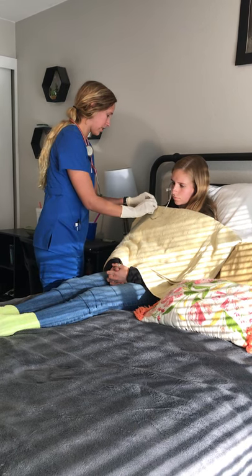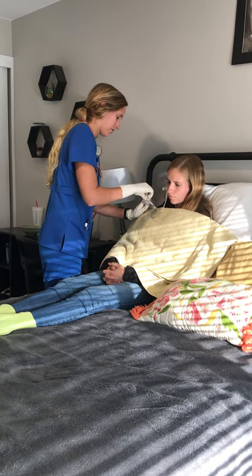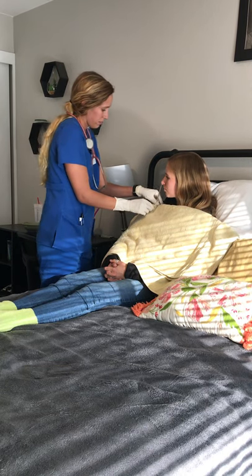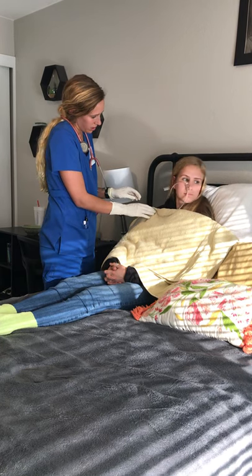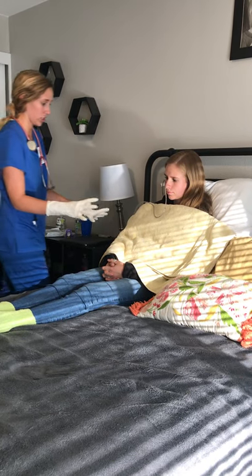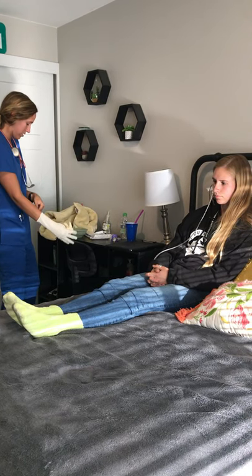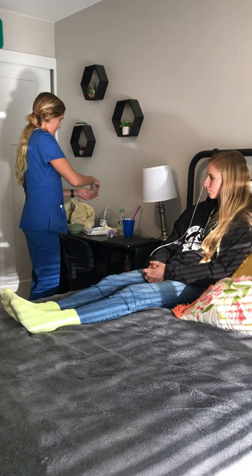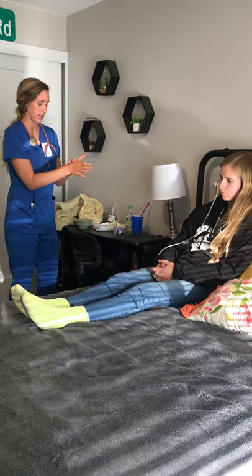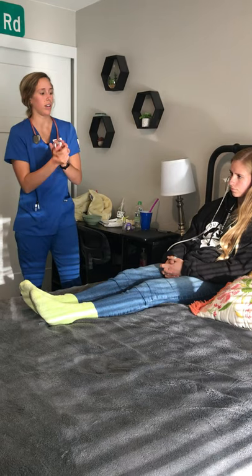Next, I'm going to secure it to her gown. Normally I'd use a rubber band and a safety pin, but I'm going to tape it instead. Can you go ahead and look left and right for me? Perfect. Do you have any discomfort while you do that? No. Perfect. I'm going to remove all of my supplies, get rid of all my trash, take my gloves off, wash my hands, and then I would document my findings.